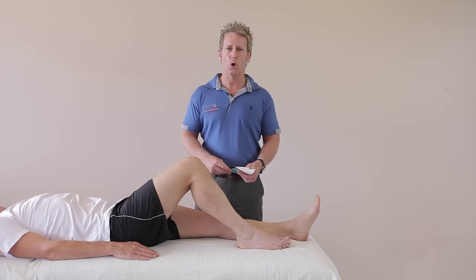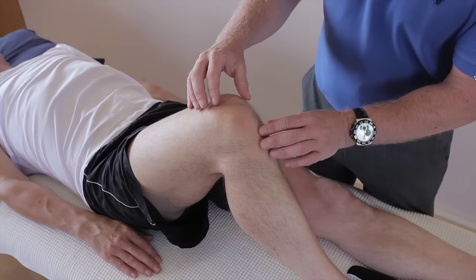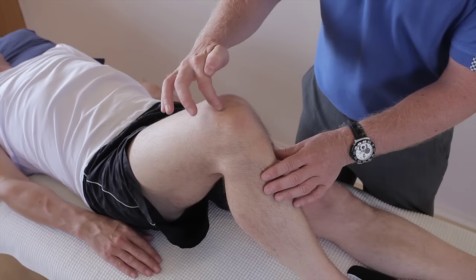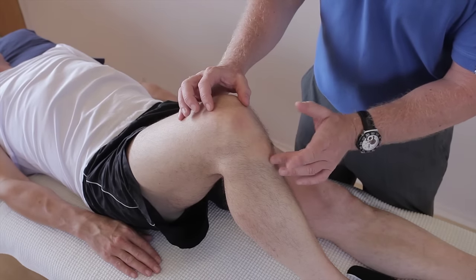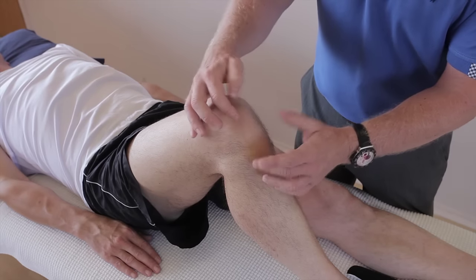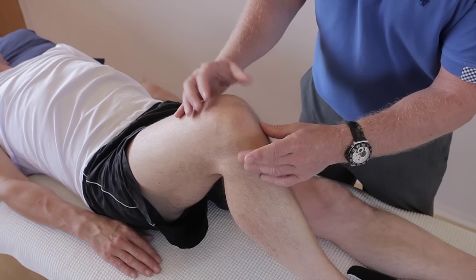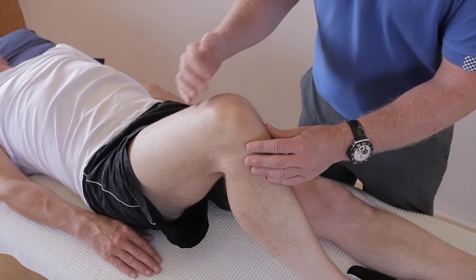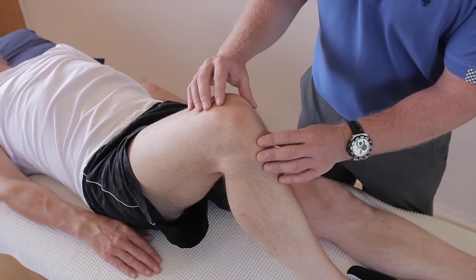In this video, this is known as full knee taping, and we're looking at conditions like patellofemoral syndrome and also inferior patellar pain. Patients that present with knee pain, a lot of them can actually have pain around the anterior part of the kneecap, inferior where the patellar tendon meets the tibial tuberosity — so we might have a patellar tendinopathy, or maybe in a younger child, an Osgood-Schlatter type of disease. They can also get pain further up where the quadriceps tendon comes in, so this kinesiology taping will work very well to offload all the pain around.